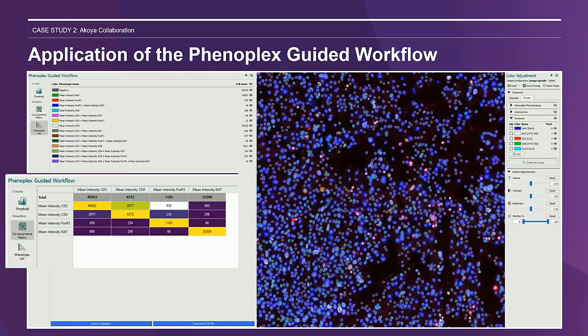As we required visualization of these labels on the image overlays, we took the thresholds defined in the module and incorporated them into the app author to phenotype all objects.